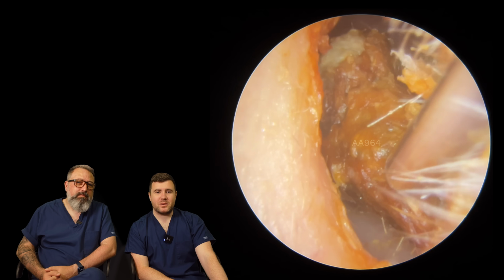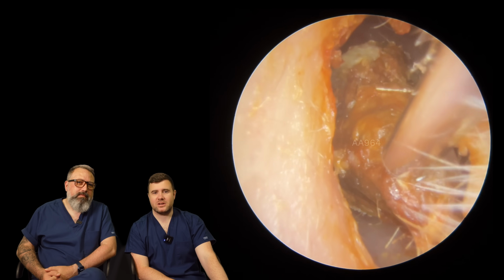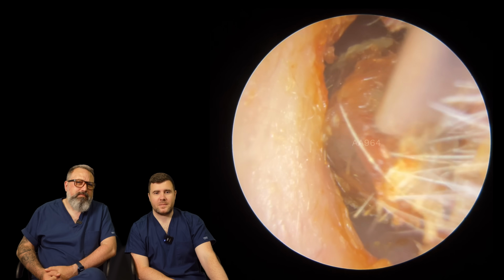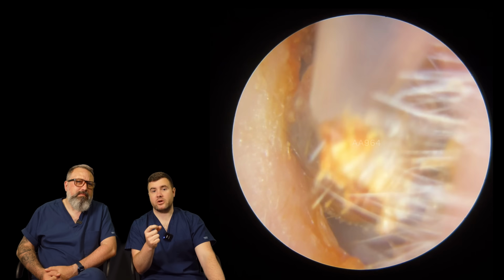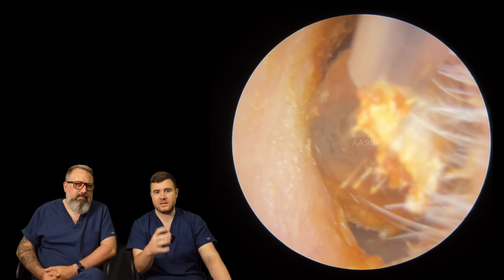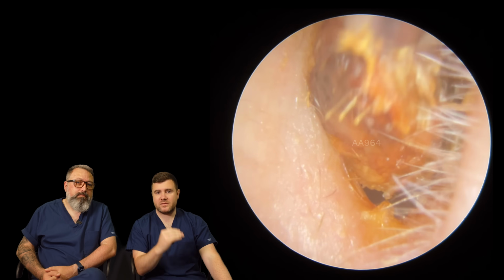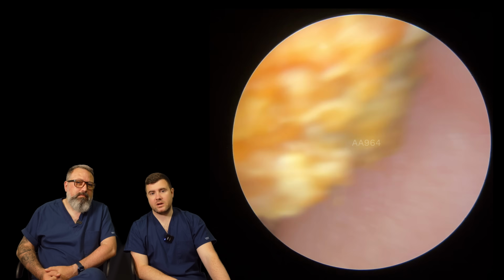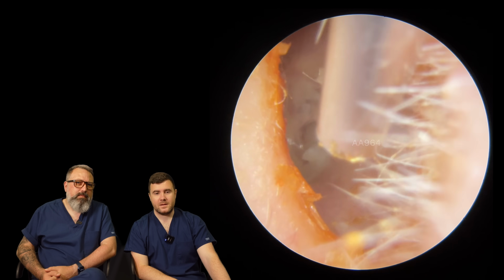We've got this deeper plug of, this just looks like normal wax. A bit of a mixture. It's dry, isn't it? Very, very dry. Squeezing it through. We're lucky we've got a little bit of a suction grip here, because I know these dry pieces can sometimes be a bit of a pain to try and remove, but we have space either side of this wax plug, so we can actually give it a little bit of a wiggle. There you go. Quite a decent size there.